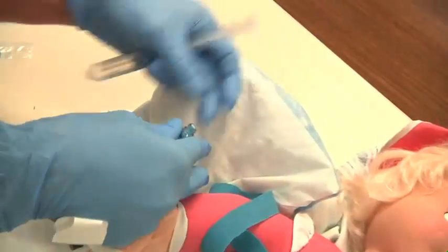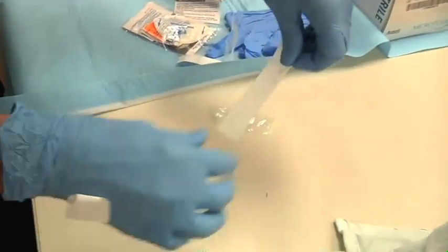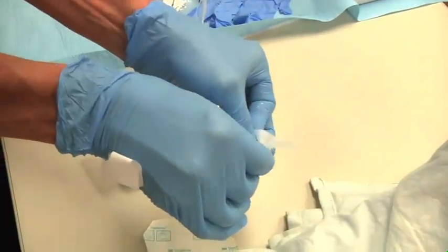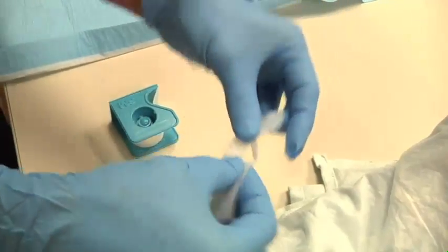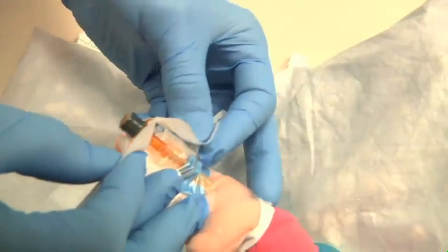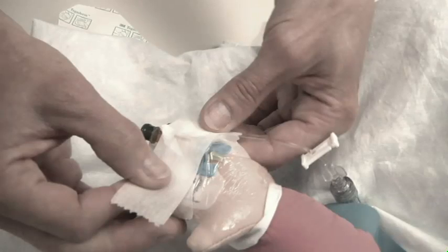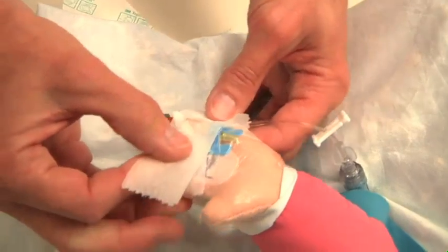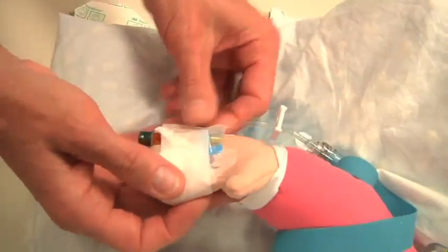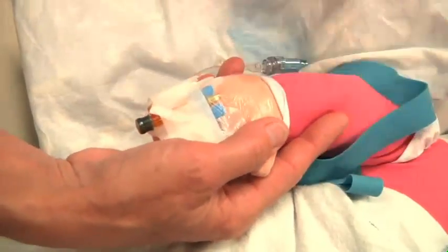Tape 1-inch paper tape, and make a small slit in the center and place it over the end of the T connector. And then take another piece of 1-inch tape and place it over the top. Never cover the insertion site with tape. It must be visible at all times. And make a loop with the T connector tubing.